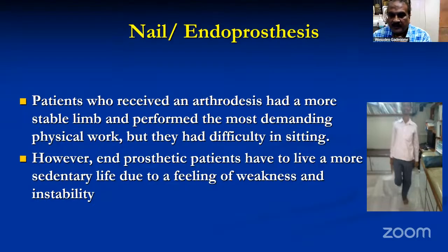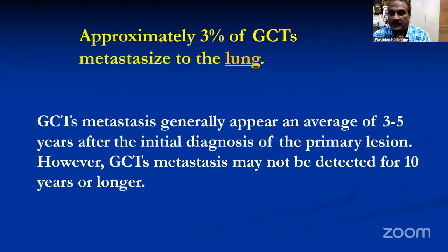However, endoprosthetic patients have to live a more sedentary life due to a feeling of weakness and instability, and looseness of the prosthesis is possible. But once the arthrodesis has occurred between the two bones, it gives a solid bony construct where the patient can do all activities of daily living except flexion of the knee joint.